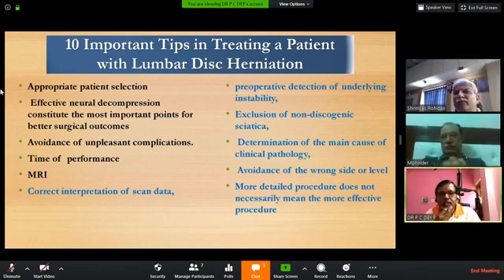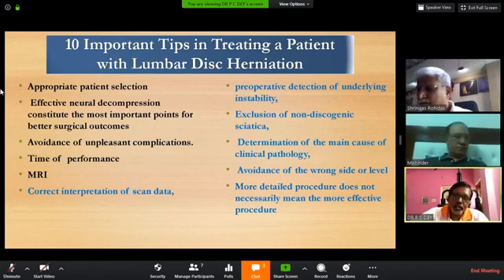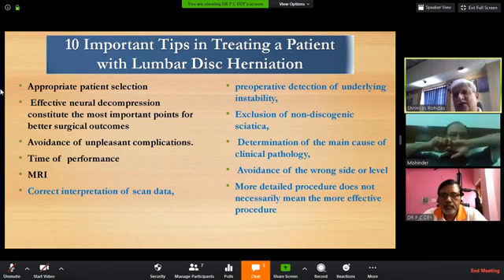So during the surgery, suppose, as you have shown here in your surgery, you are putting a neuropatty cranially, and then you are putting that at the lateral aspect of the nerve root, the traversing root, and then you are pushing the nerve root with the dura a little bit medially, creating the space laterally, so that you can see the disc space properly. Here it is extruded and migrated upward. How can you put the neuropatty cranially? That is why you have to decompress it nicely, so that you are able to retract it medially.